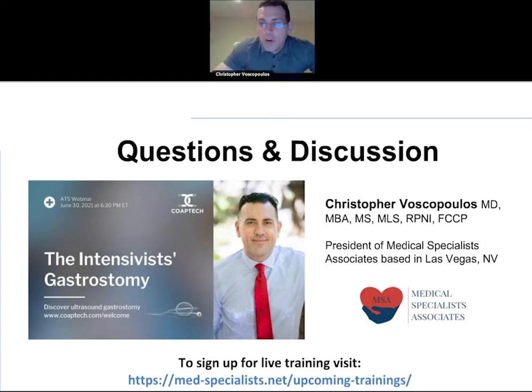I'll take the next question here, which is, what is your abdominal wall thickness limit to do it safely? Personally, and I'm just speaking for personal comfort after doing the procedure, I have a comfort with about 6.5 centimeters or so to do this procedure. I have not yet had the experience or willingness to try it on individuals with much more at the moment.